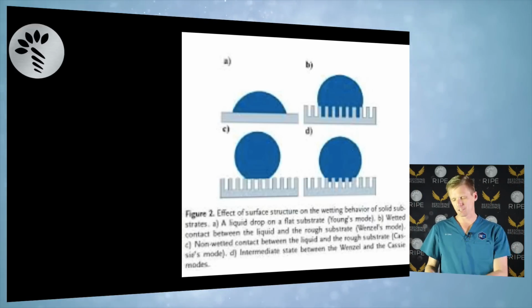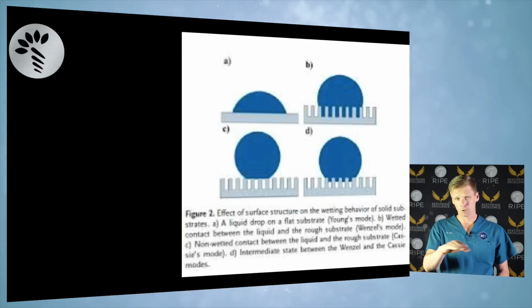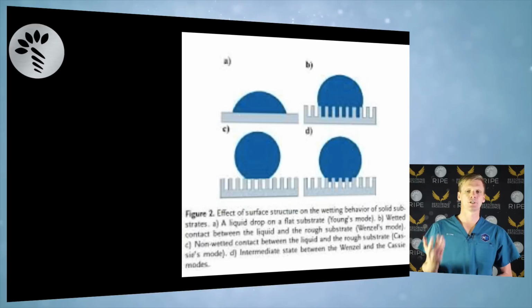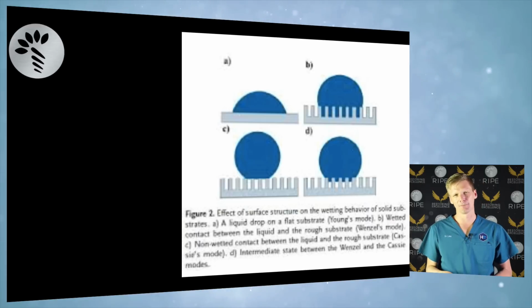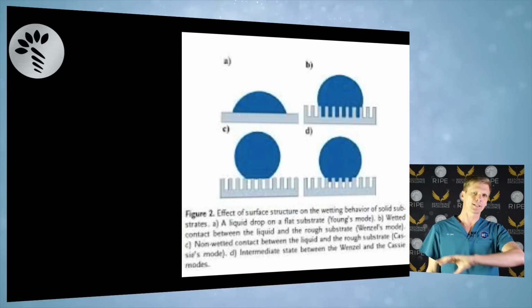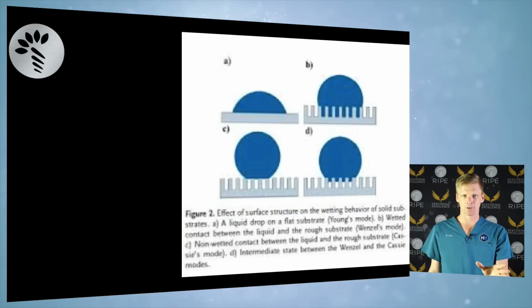If there's water on, you can have water going while you're polishing. You can use water with a Softlex disc, although I don't usually. I polish with a coarse Softlex disc, and then I use my standard polishing kit, which I use for composites. I don't go to superfine anymore. I used to, just to show off, but I don't need to show off anymore. So I'll polish with a white cup, and then sometimes my purple cup. I'll never go to the brown cup, which is the one that gives a super gloss to composite.